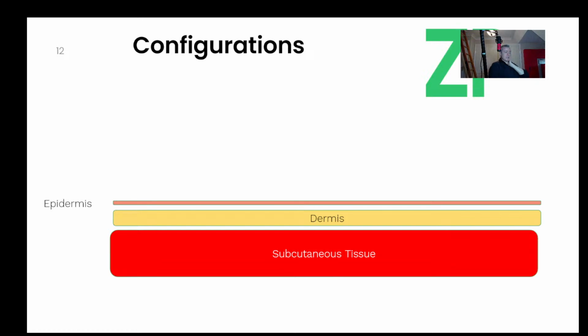But I think the statement is, people, you really can't trust non-invasive glucose monitoring. When they talk about non-invasive glucose monitoring, I think they're referring to some watches you can get on Amazon that say they're CGM or glucose monitoring. I don't say it's not true, but the FDA is saying you can't rely on them.